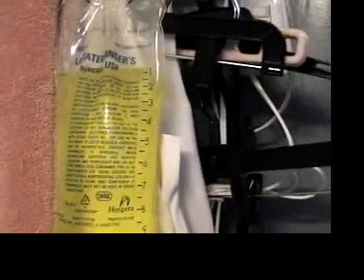One more look at the fluids, you can see that we did go down about halfway to the 1. So she got about 50 milliliters, maybe a teeny bit more. Done. I use my hanger to hang my line, and I put it behind this towel, covering it with the towel, because B-complex degrades with light exposure. So this way my fluids are protected from light.